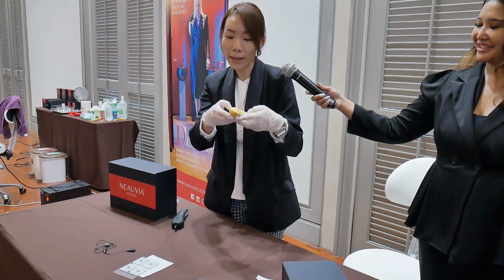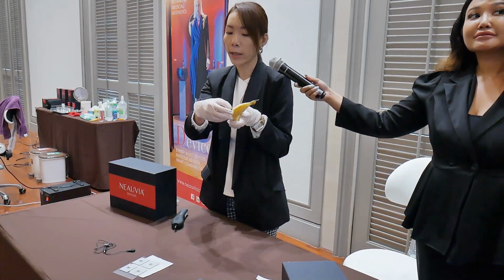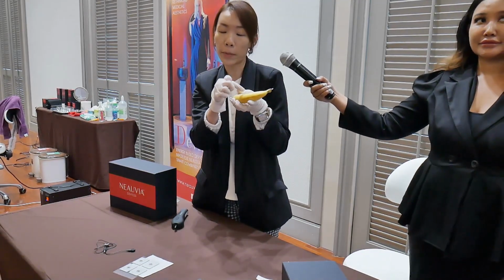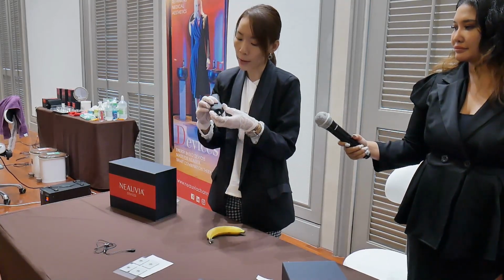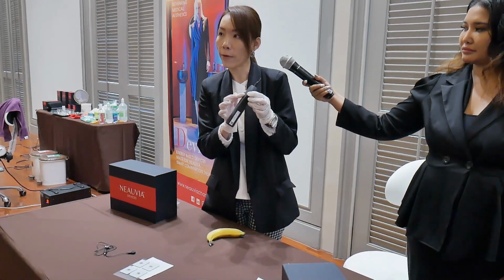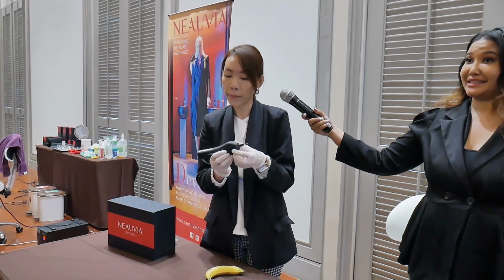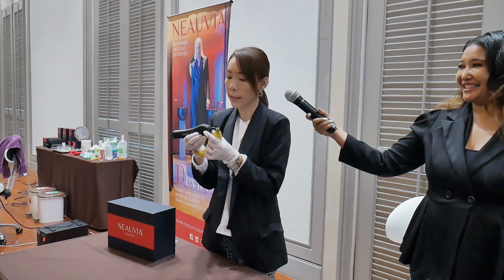So assuming I do a line here, I have a wrinkle here. Okay, this is a wrinkle. Assuming I will be doing the treatment along the wrinkle, I will start off with, and remember, Alex mentioned that you have to have a finger here to close the loop. And then you have this like that. You have to be very close to the wrinkle, the skin, but not touching the skin.